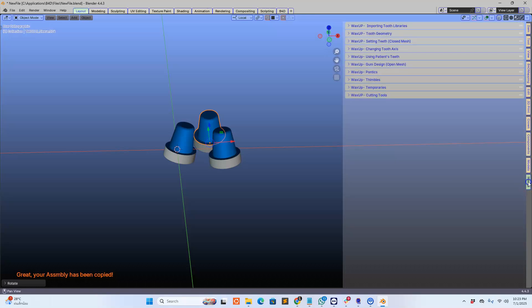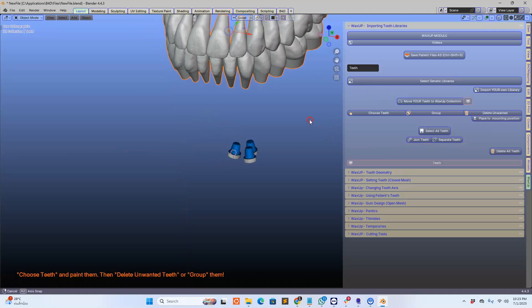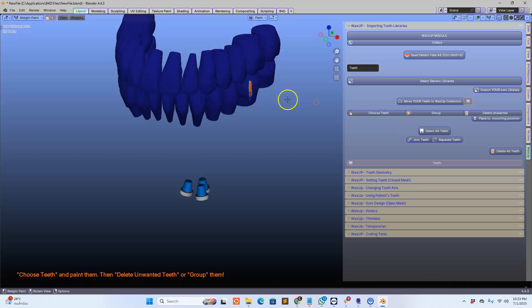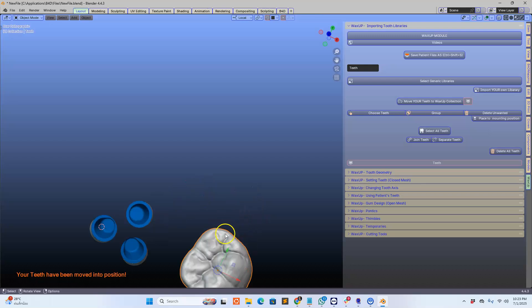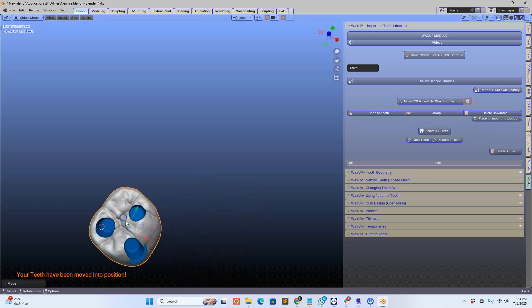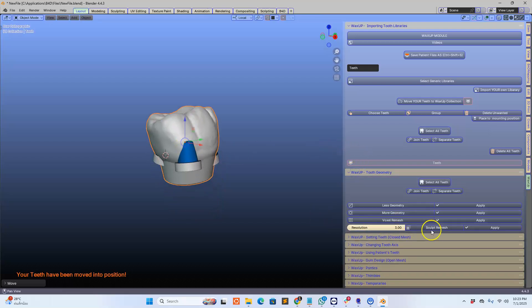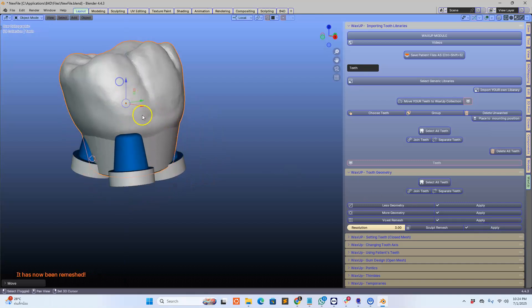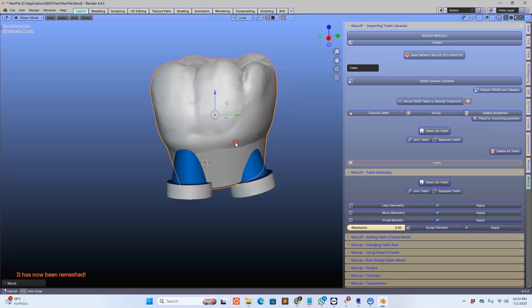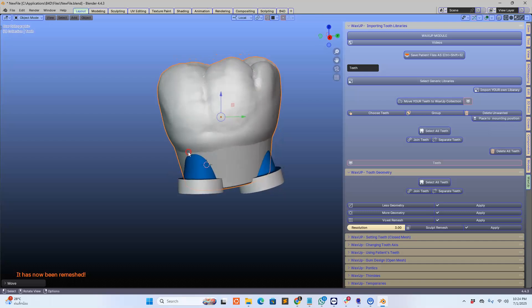Go to the wax up module and I'm going to import a tooth. I'm going to select a molar over here, delete unwanted, and place it to the position. I'm going to move that to where my abutments are, and while I'm at it I'm going to remesh this tooth geometry and place it into a position. Let's see how Blender for Dental can do something this complicated.